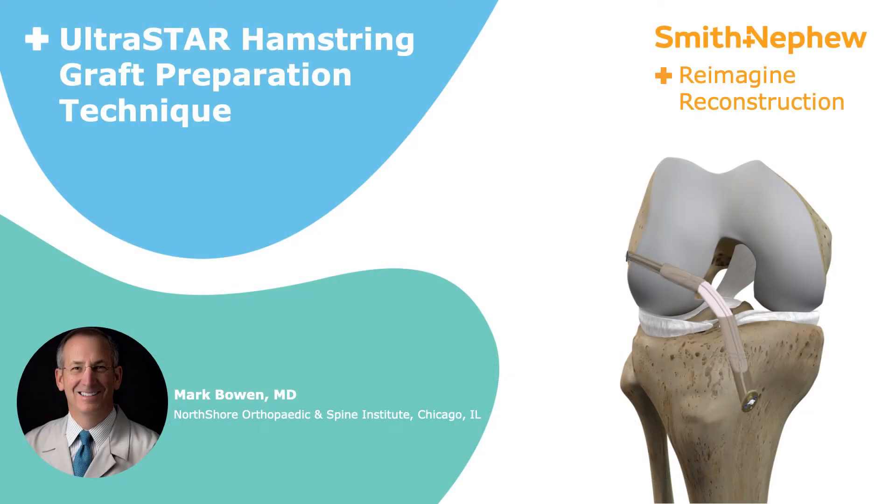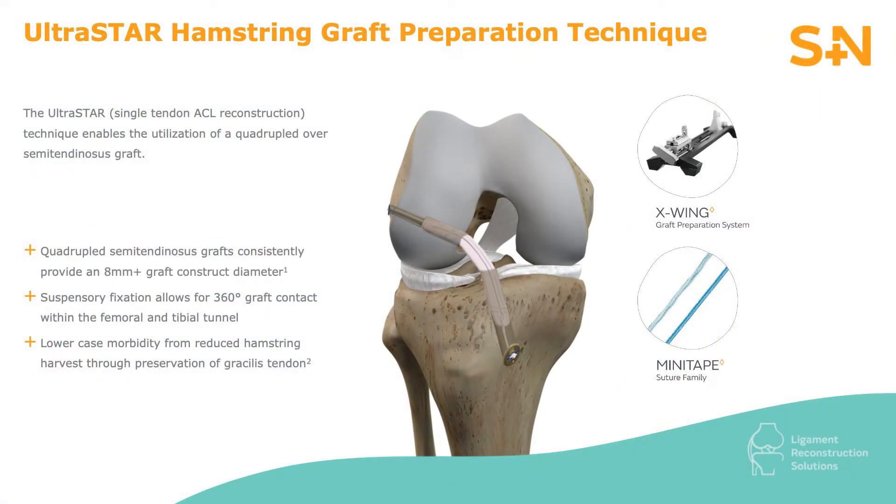My name is Mark Bowen. I'm an orthopedic surgeon specializing in orthopedic sports medicine. Today we're going to be demonstrating the preparation of a single quadrupled semi-tendinosis tendon using two ultra buttons.